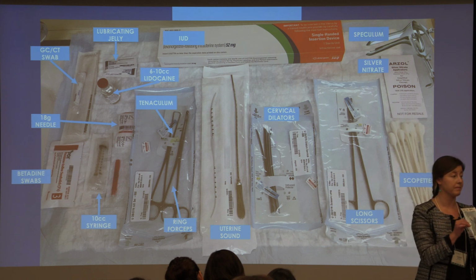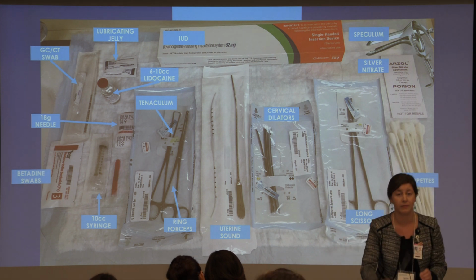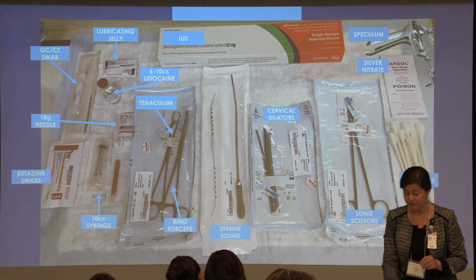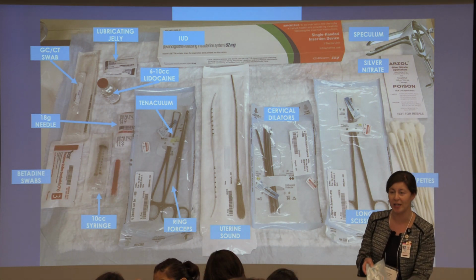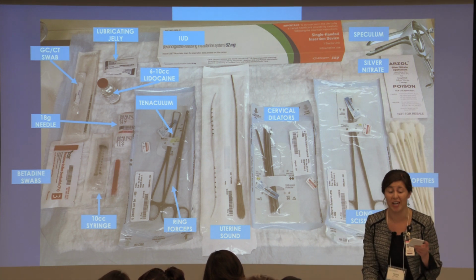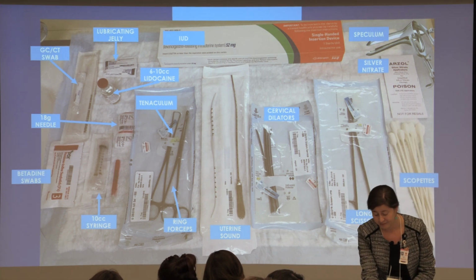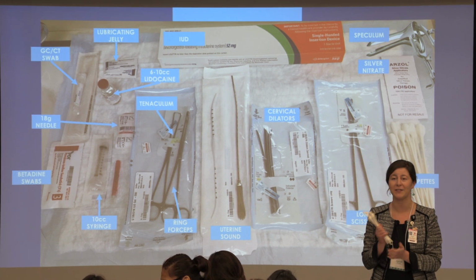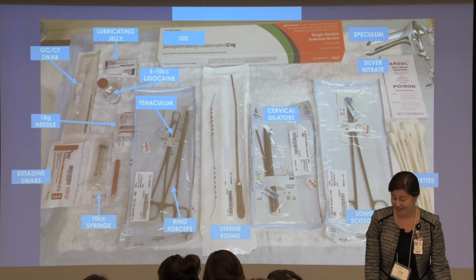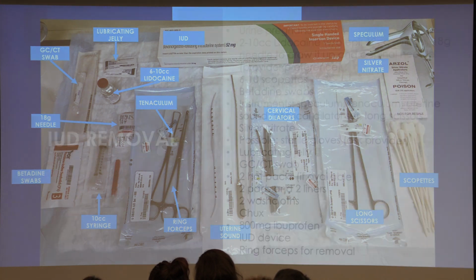Cervical dilators. The device itself. Long scissors, to cut the strings. Available silver nitrate to help with bleeding. And then scopettes. Lots of scopettes available. So that is our tray setup for insertion of IUD. Any questions with insertion? Supplies, instruments needed there? Okay.